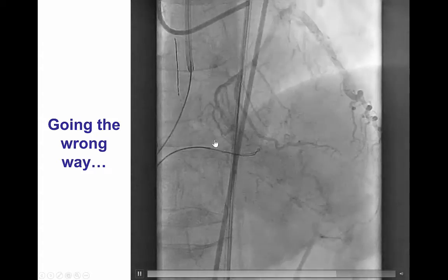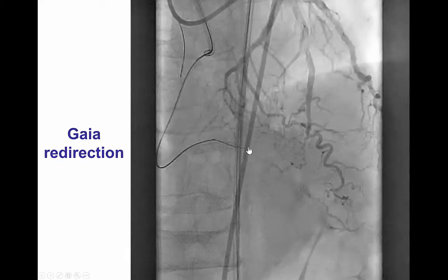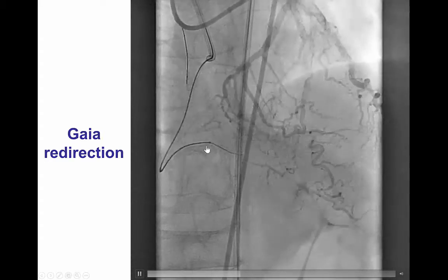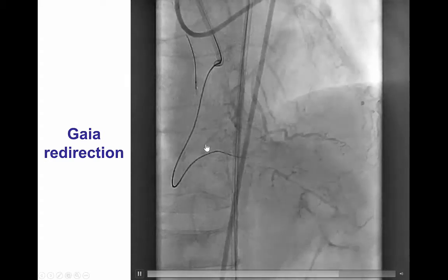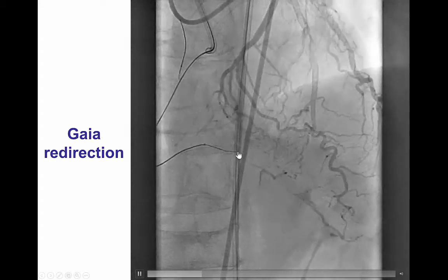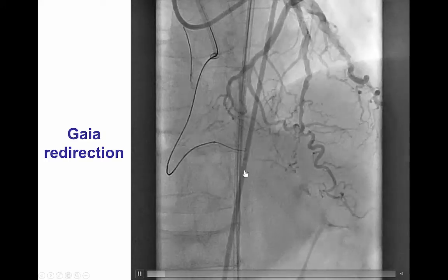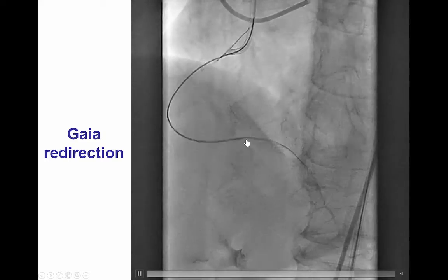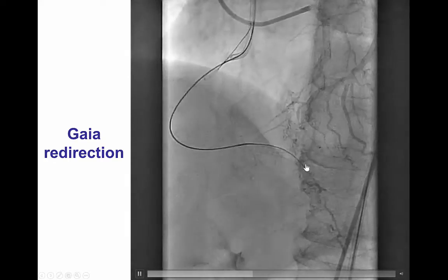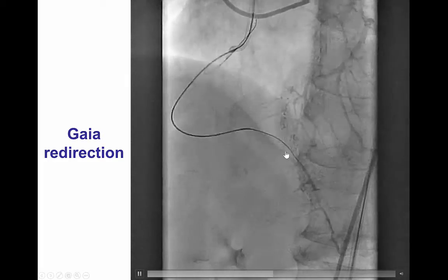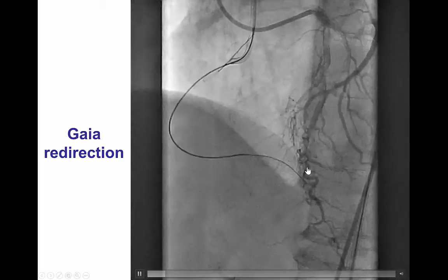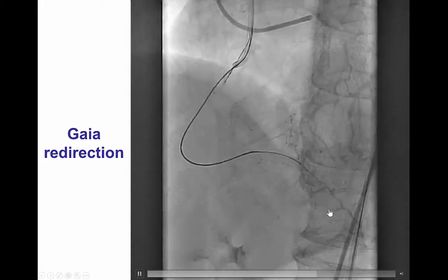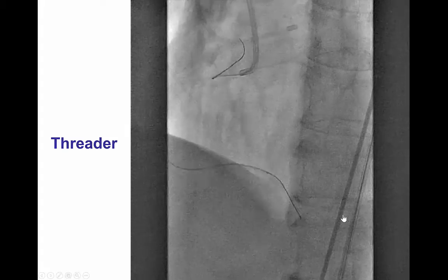However, the wire was now going into a small side branch. We used the GAIA composite core guide wires to redirect into the direction of the posterior descending artery, and by doing that we were finally able to advance the wire sub-intimally into the right posterior descending artery, which was moving very nicely in sync with the posterior descending artery.